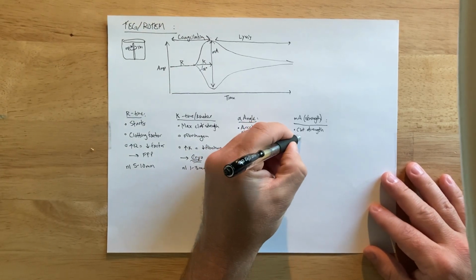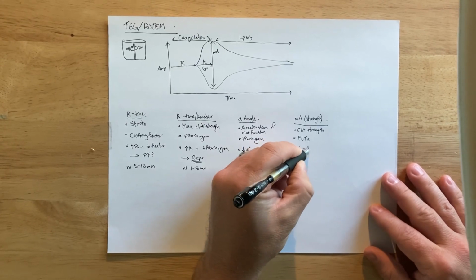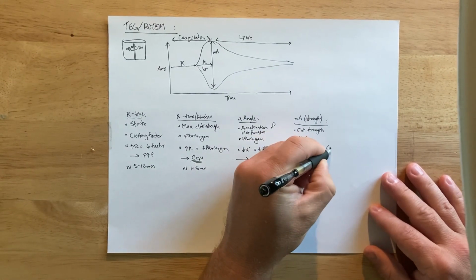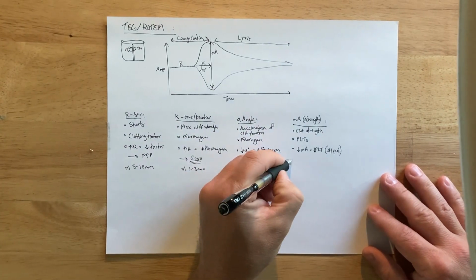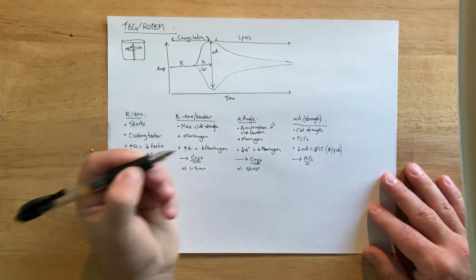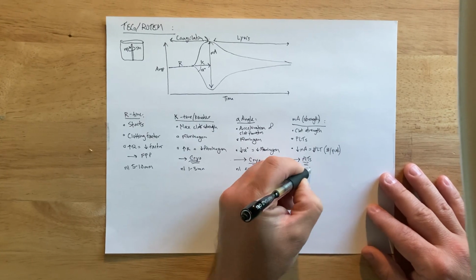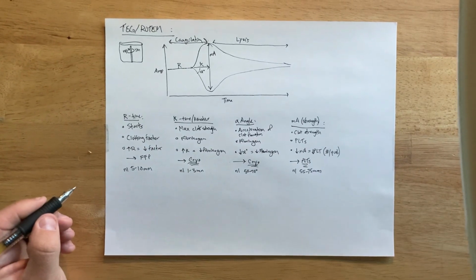This is a function of platelets. So if you have a low maximum amplitude, that means there's something wrong with the platelets, their function or quantity, or quality. Okay, so what you give for these patients is platelets. And a normal value for this is 55 to 75 millimeters of clot strength, which is its unit.